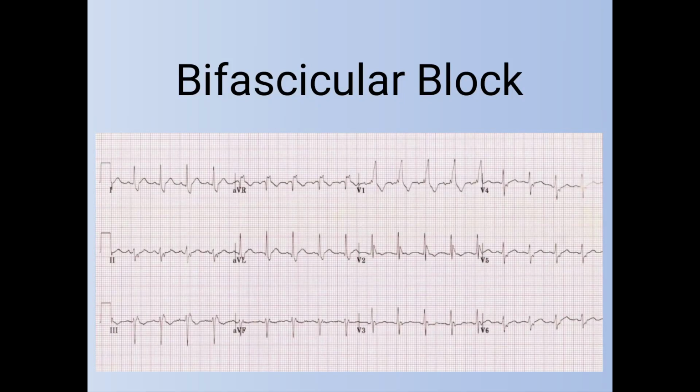Hi friends, in this video of ECG basics, today I will talk about bifascicular block.